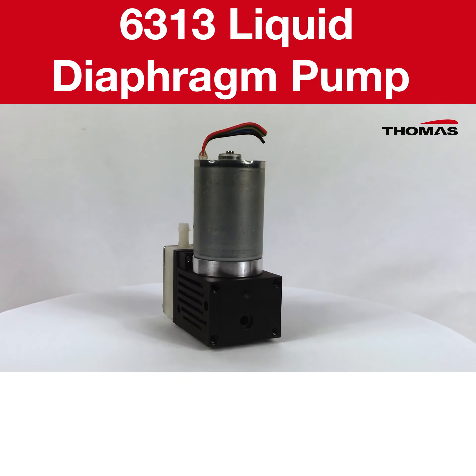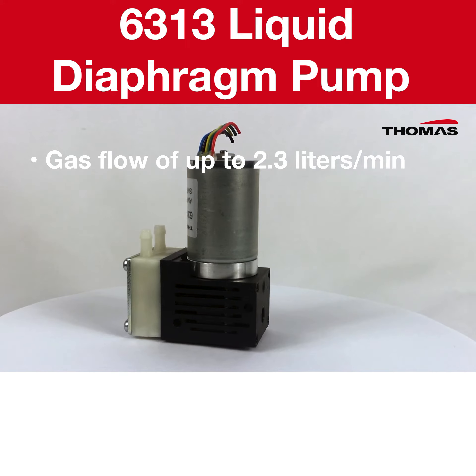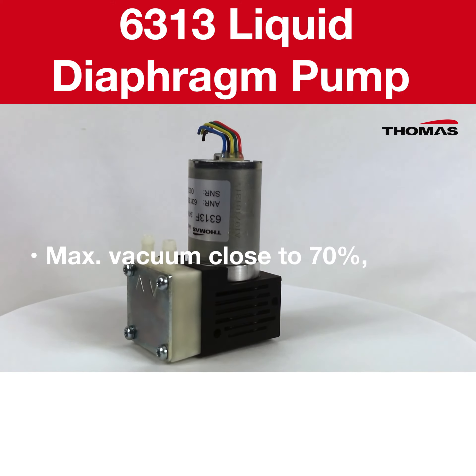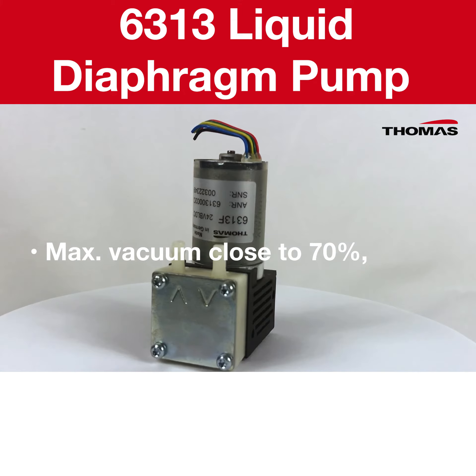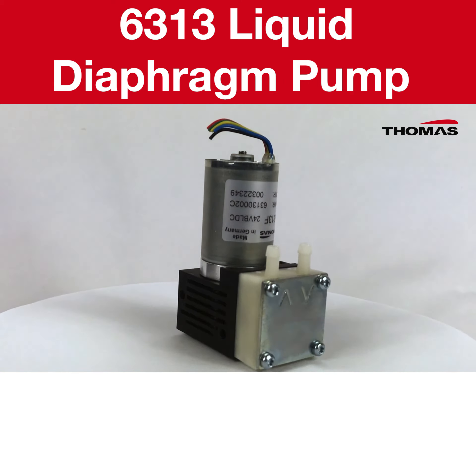To summarise, our 6313 provides you with best-in-class aspiration performance with a gas flow of up to 2.3 litres a minute, liquid flow of up to 350 millilitres a minute and a maximum vacuum close to 70%, which ensures the residue-free removal of sample liquids making it the ideal fit for you and your application.